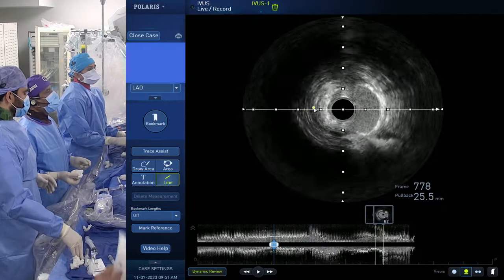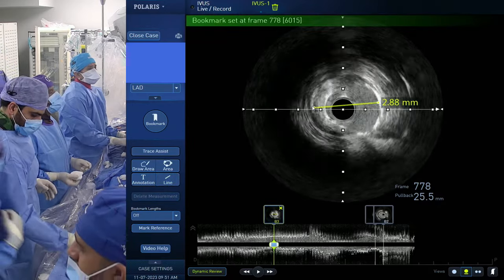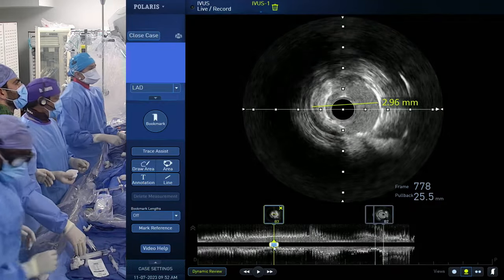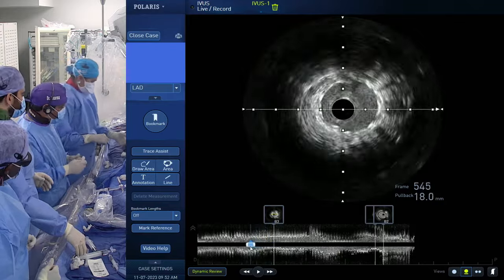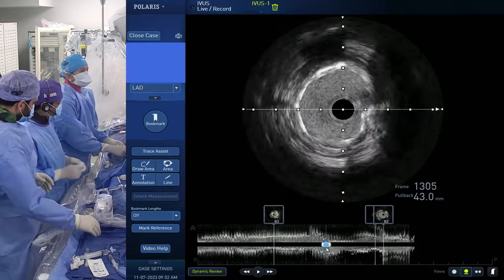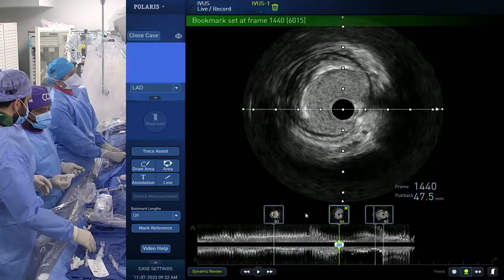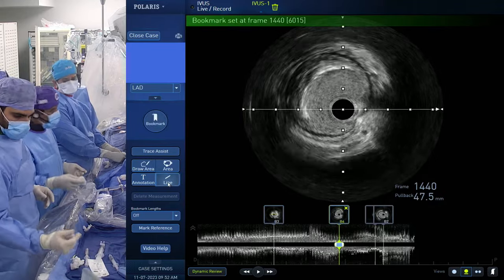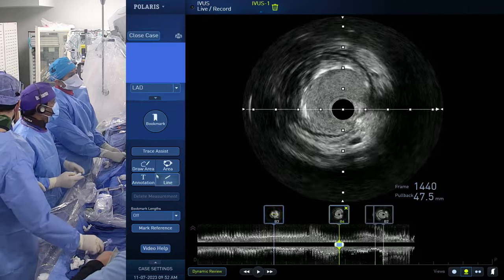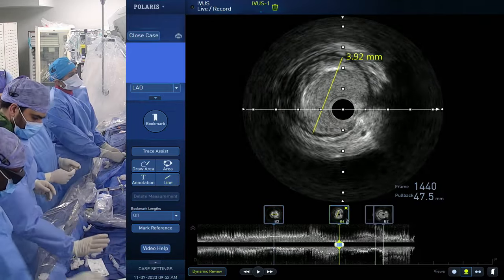Here, this is the distal part of the stent. Even the vessel size is like 2.9. But we can dilate with the 2.5 at a little higher pressure. We have not post-dilated. Remember, we deployed 2.75 and dilated with 3 a little proximally, not in that area. Okay, now come proximal. Then you can see the proximal edge. Proximal edge is on the plaque. Here there is quite a bit. The vessel size is kind of huge. Maybe we can post-dilate.